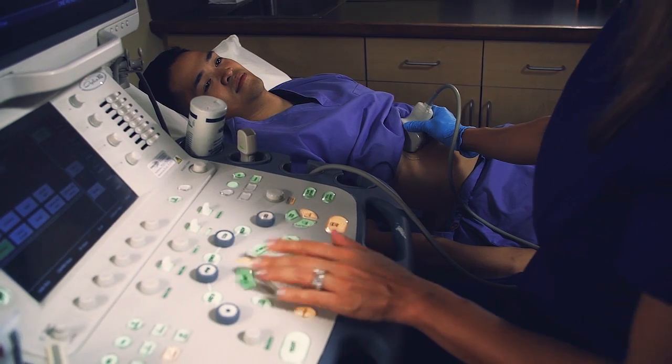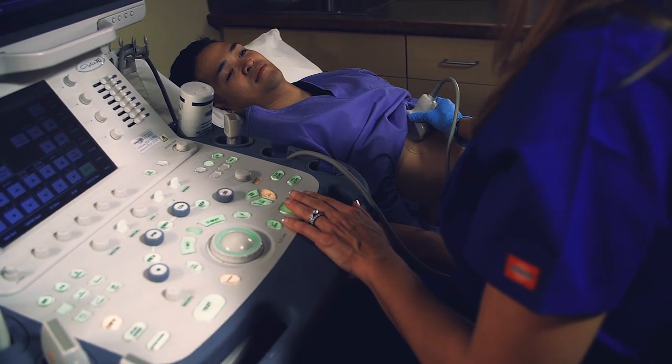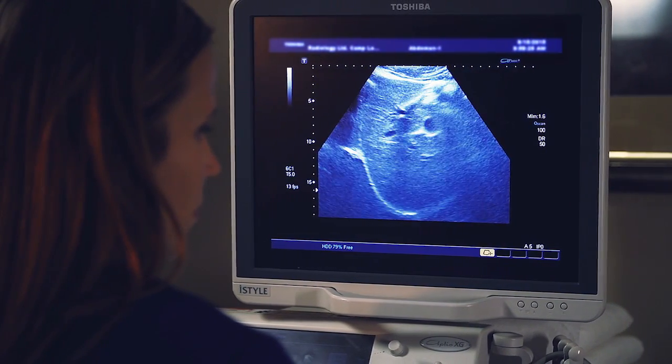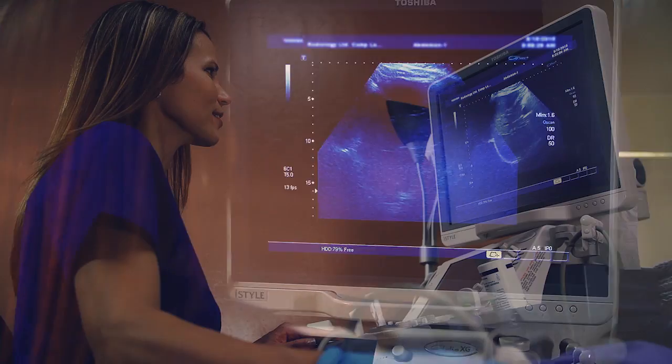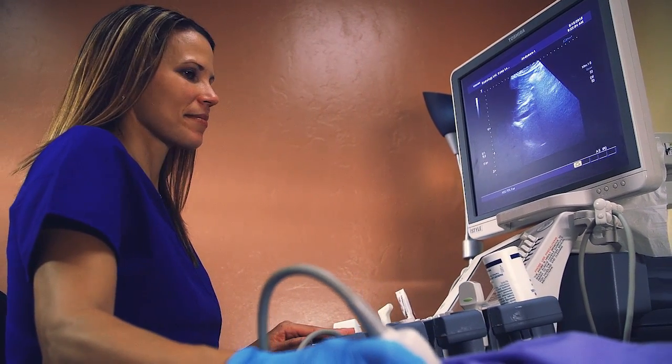The transducer generates and receives high-frequency sound waves. The computer in the ultrasound unit processes and converts the resulting patterns into detailed images. This exam produces images of soft tissue and organs in the body through the use of sound waves that reflect back and are displayed as real-time images.